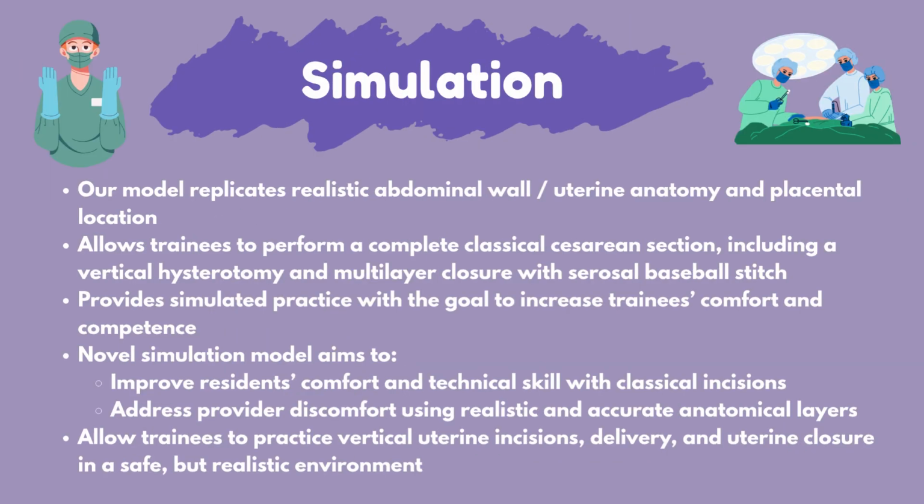Our model replicates realistic abdominal wall and uterine anatomy, placental location, and allows trainees to perform a complete classical cesarean section, including vertical hysterotomy and multi-layer uterine closure with serosal baseball stitch technique. By providing simulated practice, the goal is to increase trainees' comfort and competence.